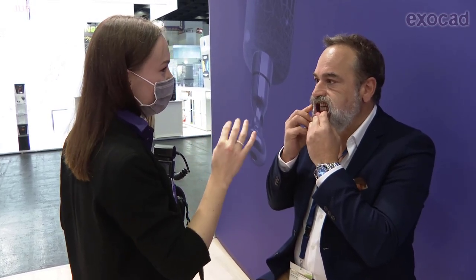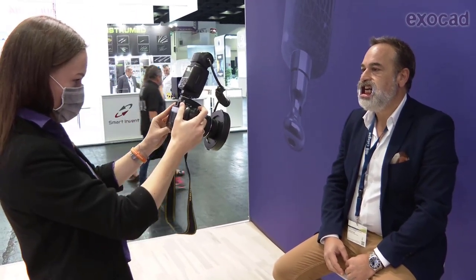It's also possible to just work with a smile picture — that would be enough — but of course it's much easier to do the registration of two pictures with 2D-3D registration when using a retractor. Now it's very important that you do both pictures from the same view angle and that the patient does not change the angulation or turn the head.